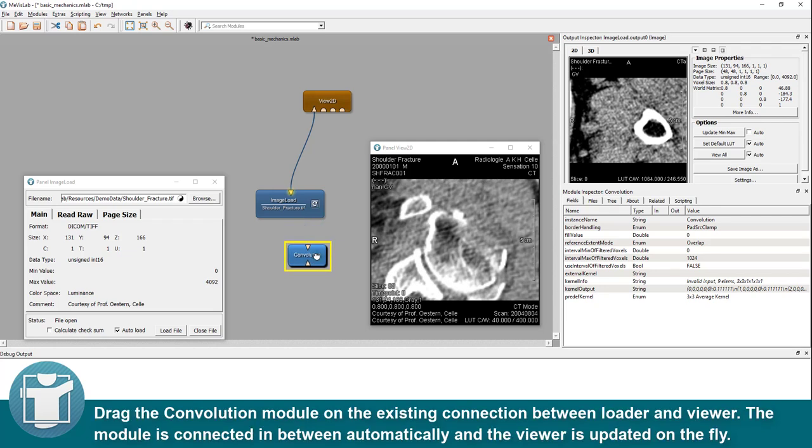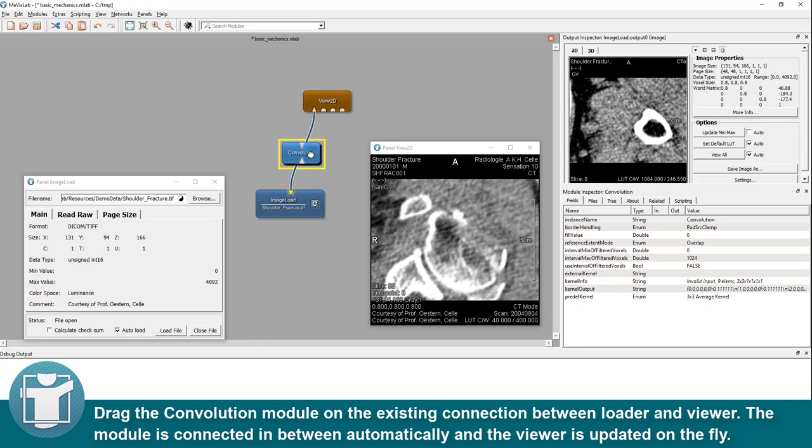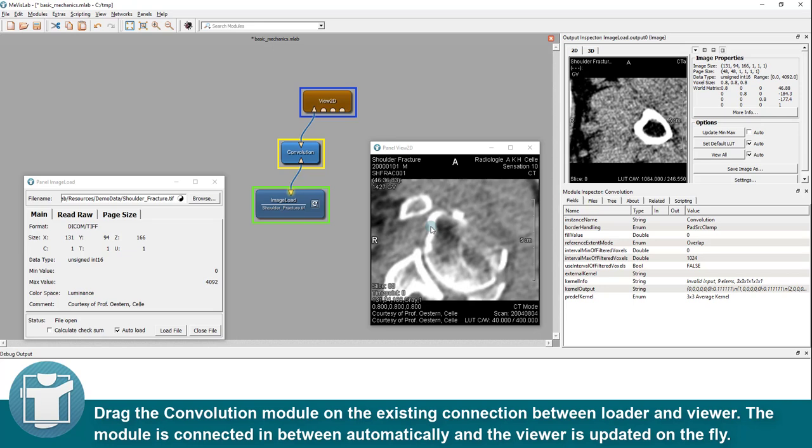Drag the convolution module on the existing connection between loader and viewer. The module is connected in between automatically and the viewer is updated on the fly.